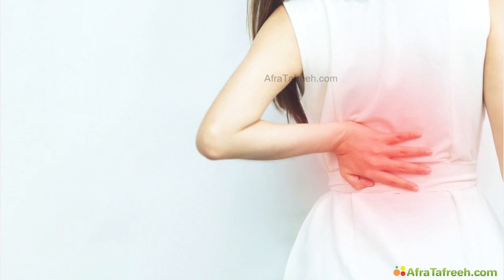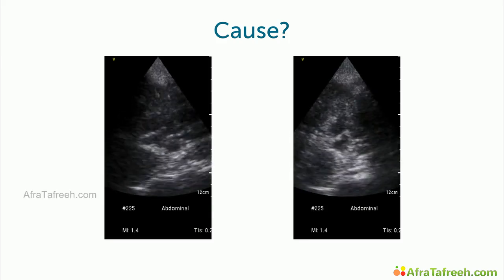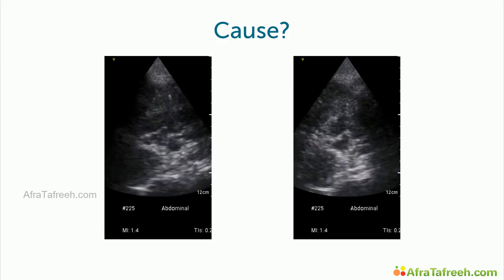In the physical examination, she states diffuse abdominal pain, but the most painful part is her left flank. Again, she has high fever, the rest of the physical is completely normal. Because of the back pain, flank pain, and the high fever, I was worried about her left kidney. Therefore, I performed a point-of-care ultrasound. Here you can see a longitudinal plane of the left kidney, and immediately you see that there is something wrong.